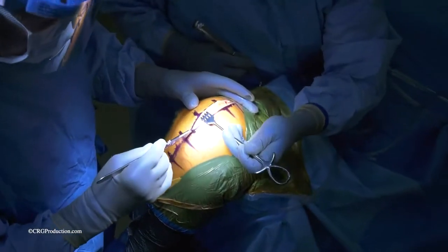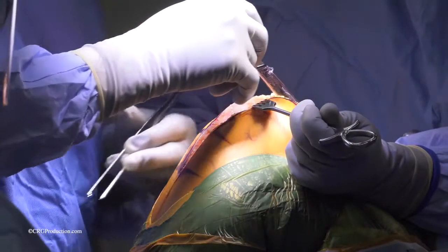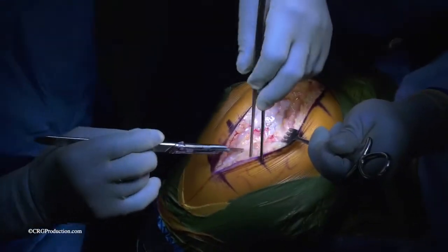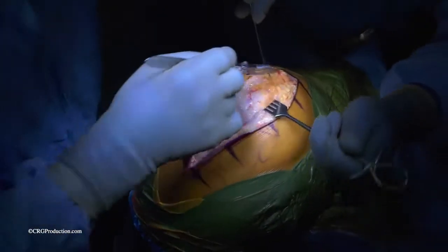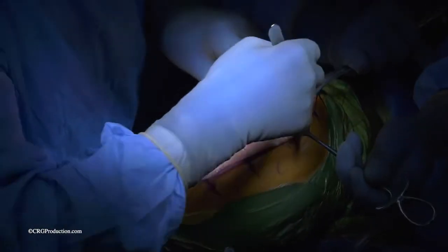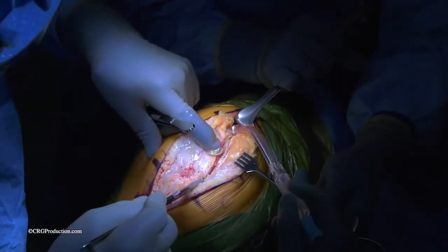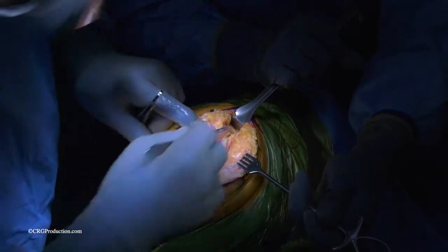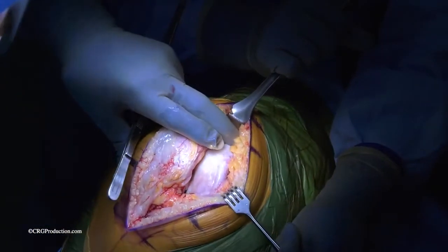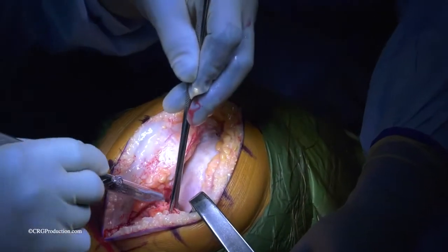The incision is made with the knee flexed. This allows the tissues to easily open up for evaluation of the knee. The incision is continued down to the muscle envelope called fascia. The fascia is then opened sharply with a knife to allow exposure into the knee joint itself. Tools are inserted into the knee to allow for better exposure of the knee joint. These are called retractors.